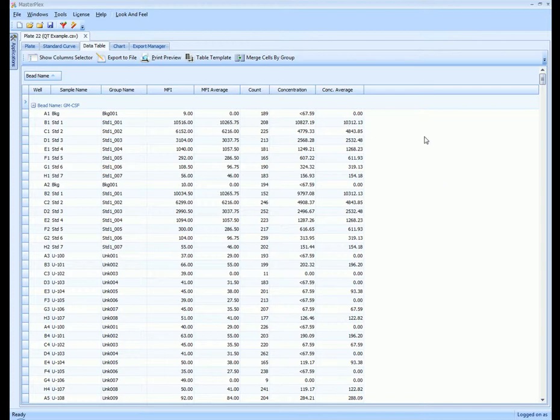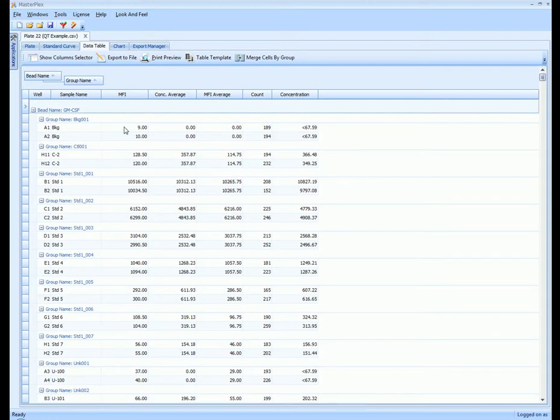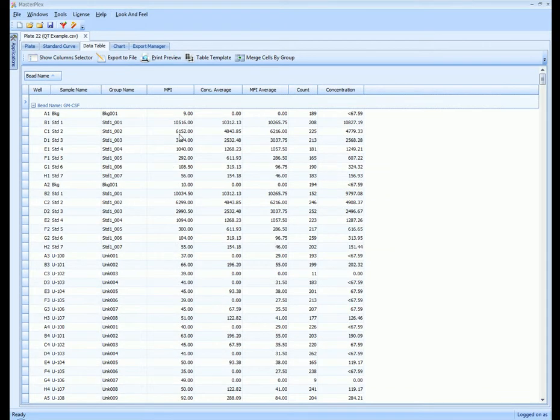There's actually a lot of functionality here, but I'll give you a quick tour of it. So the first thing is this is just sort of the default view. All of these columns are movable, so you can drag and drop them in the order that you want. You can even create sub-sorted reports, sort of similar to an Excel pivot chart.